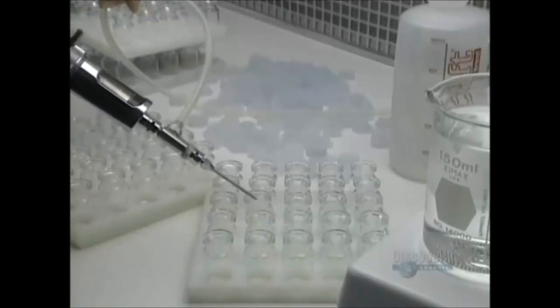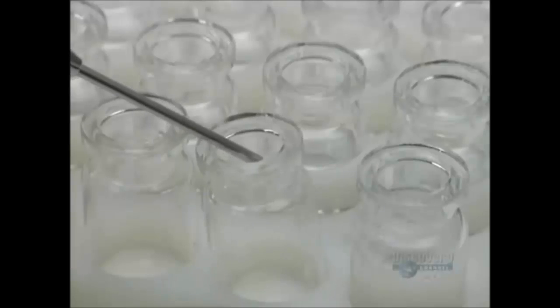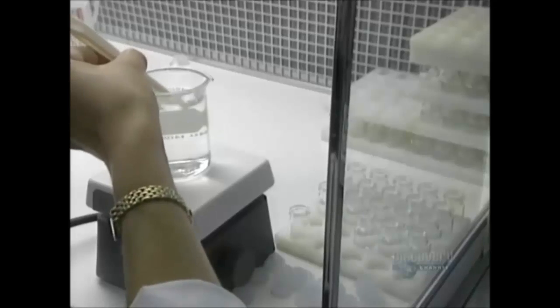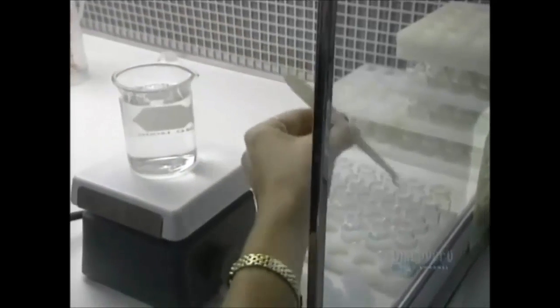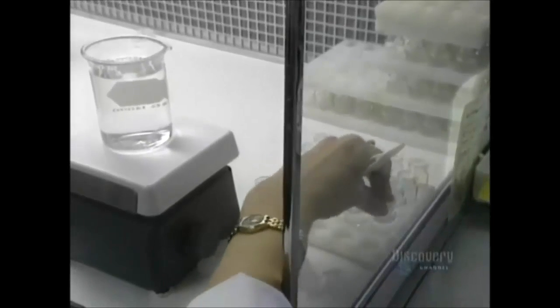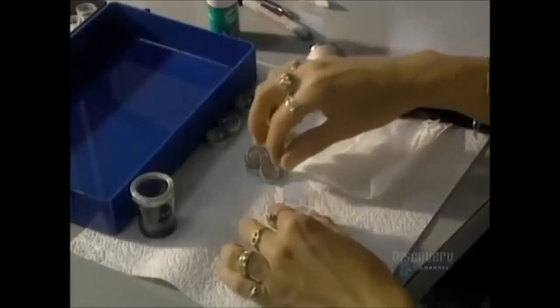Lenses are now completed, cleaned, and stored in containers filled with saline solution. This little vial, the kind found at an optometrist, is perfectly sealed with a silicone cap and another of aluminum.